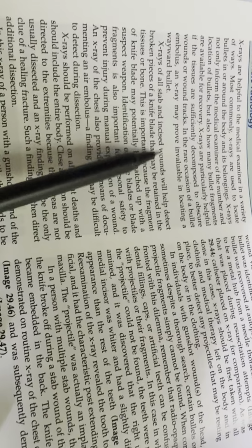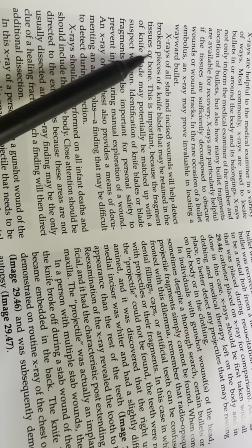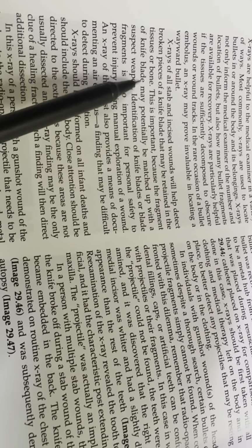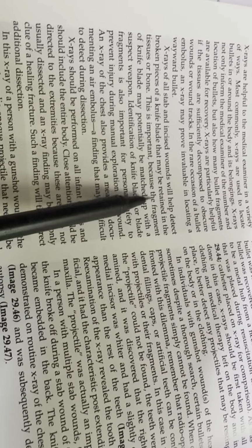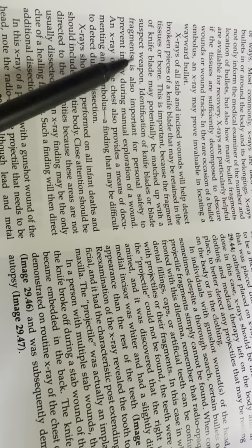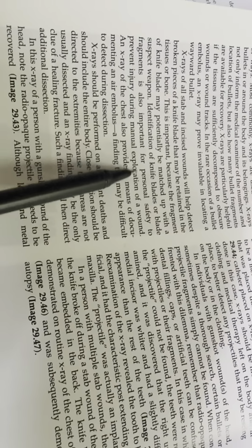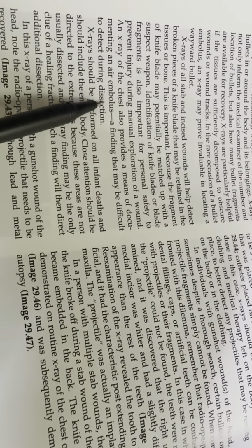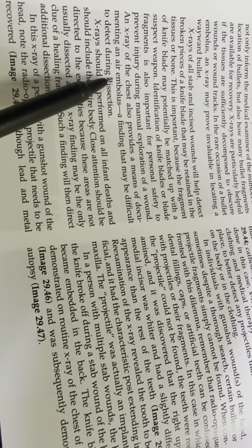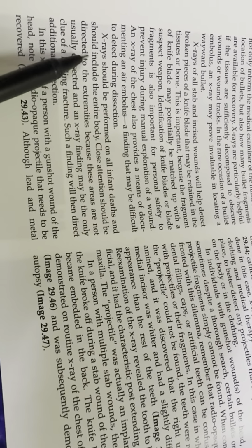X-rays of all stab and incised wounds will help detect a broken piece of a knife blade that may be retained in the tissues or bone. This is important because the fragment of the knife blade may potentially be matched up with a suspect weapon. Identification of a knife blade or blade fragment is also important for personal safety, to prevent injury during manual exploration of a wound. An X-ray of the chest also provides a means of documenting an air embolus, a finding that may be difficult to detect during dissection.